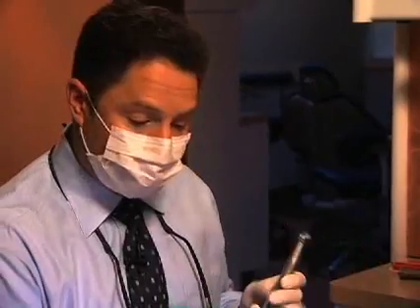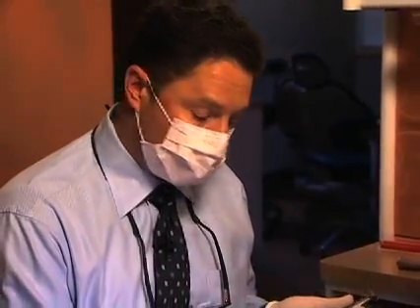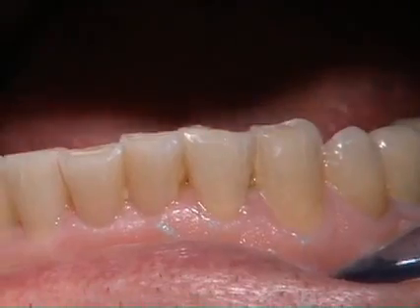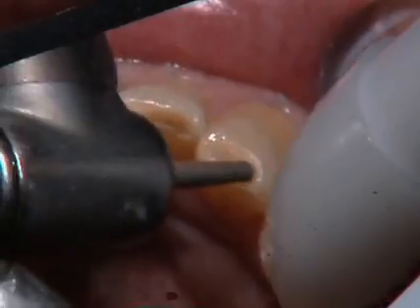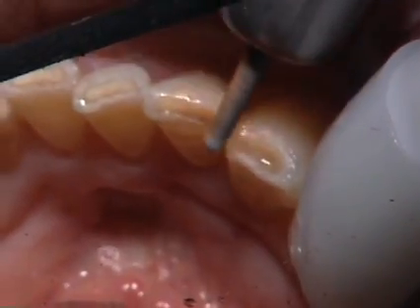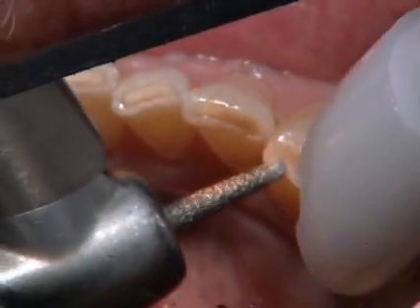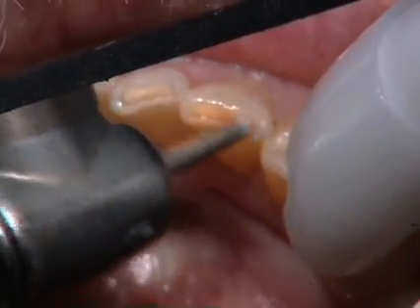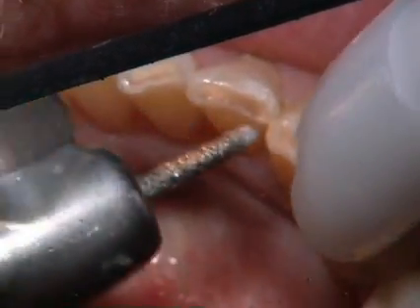We're going to do a little bit of prepping here — in this case, mostly just to roughen up the tooth surface. There's a little bit of decay on number 23. The idea is to get a nice, freshly tooled enamel and dentin to bond to. So we're going to roughen up the dentin and create a slight bevel on the enamel, removing any loosened enamel rods. That's pretty much the prep on number 22. On 23, a little bit of decay removal, with a slight bevel facially and lingually.